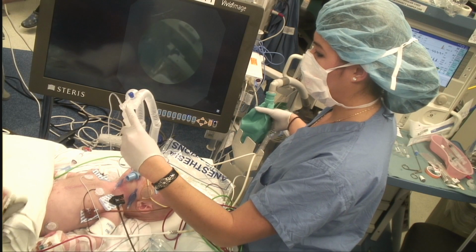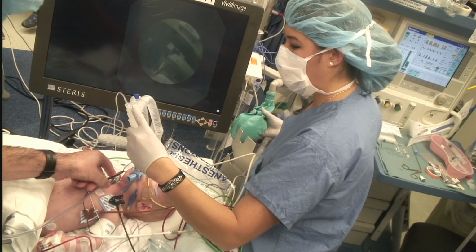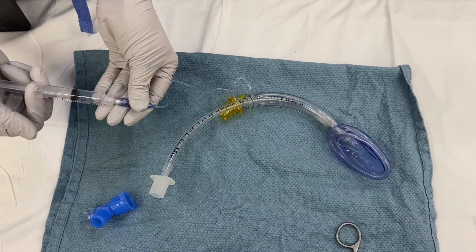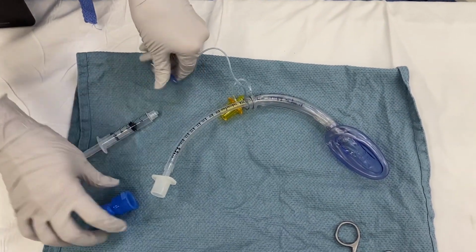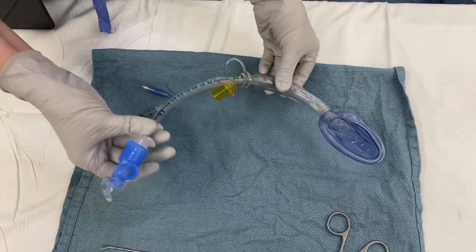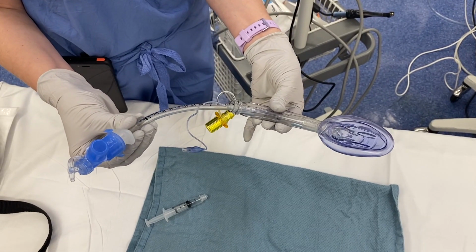Ventilation and seal should be verified before attempting intubation. As the conduit is large enough to pass a pilot balloon, which is similar in size to a 5.5 millimeter inner diameter tracheal tube, most pediatric patients will require that the tracheal tube has its cuff fully inflated within the airway conduit of the supraglottic airway to effectively seal the system.